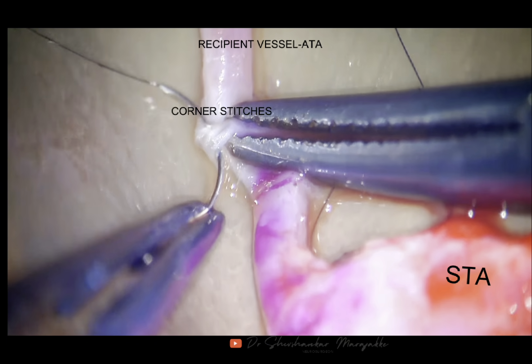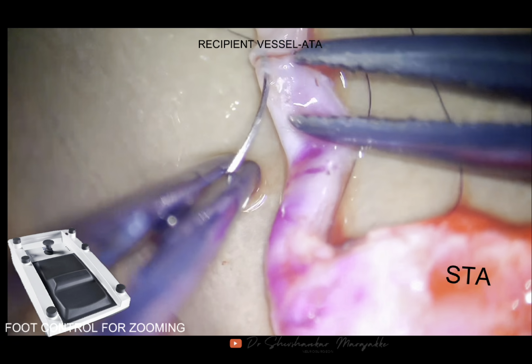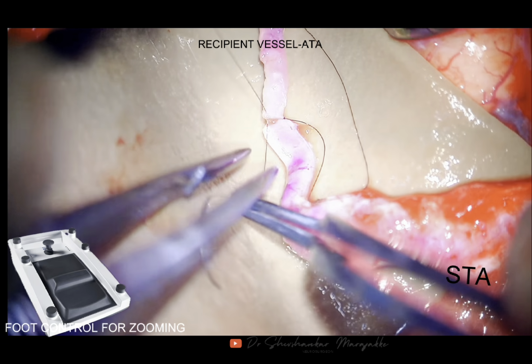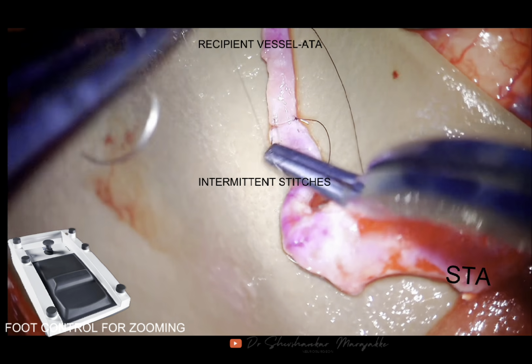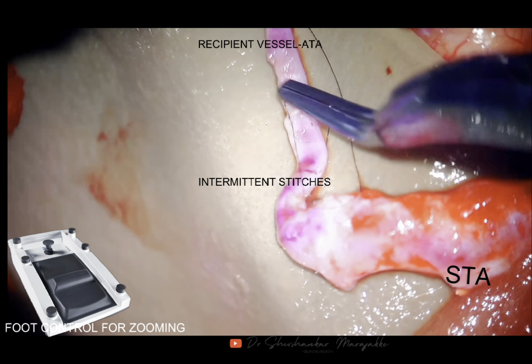Sometimes in this case we have quite a long graft, and even the anterior temporal artery is mobilized. Otherwise, if the gap is too long and the arteries are under tension, knots cannot approximate the ends. So suture pull-through of the walls happens, the lumen collapses on itself, and the arteries do not rotate. That is difficult, but in this case it is quite easy.